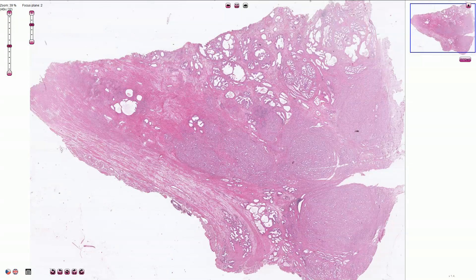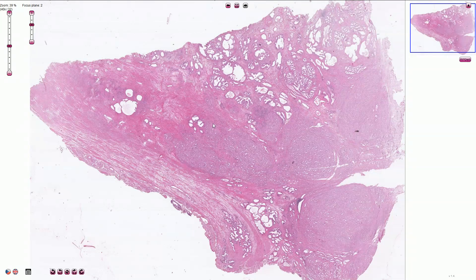Prostatic carcinoma, also called acinar adenocarcinoma, is a very common malignant neoplasm of prostatic secretory cells. The diagnosis is based on morphological, architectural, nuclear, cytoplasmic, and intraluminal features. Most cases arise in the peripheral parts of the prostatic gland, and therefore it can be easily sampled by core biopsies and can also be palpated on per rectum exam.